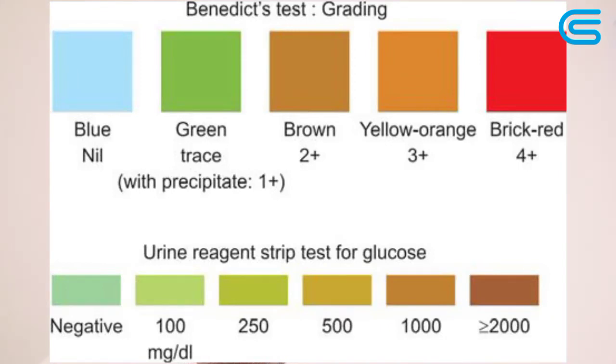So it is this blue color that helps us to determine the amount of glucose in urine. The nature of the chromogen and buffer system differs in different strips. Of course, from strip to strip, depending on the manufacturer, there will be different natures of the chromogen. So the strip is dipped into urine sample, and the color is observed after a specific time and compared with the color chart provided.